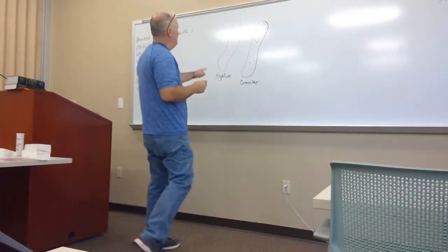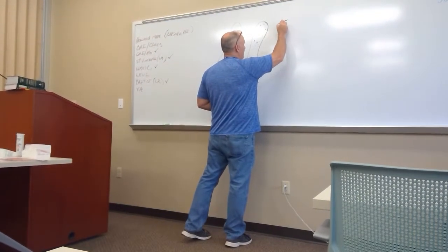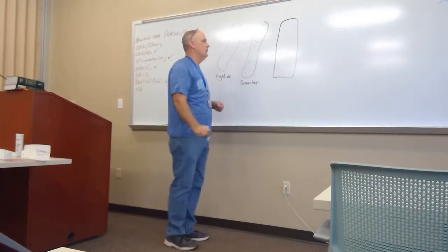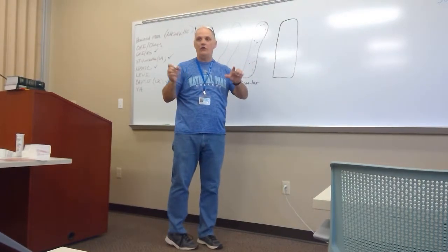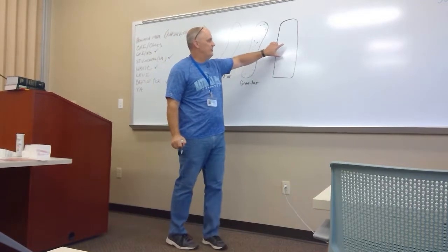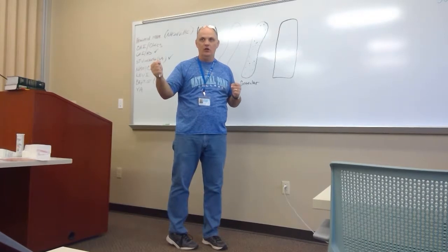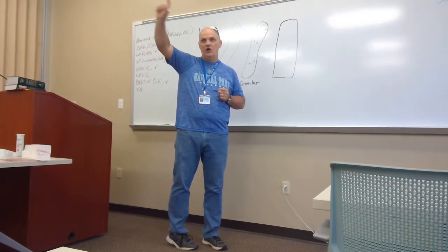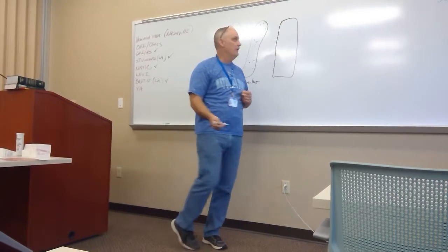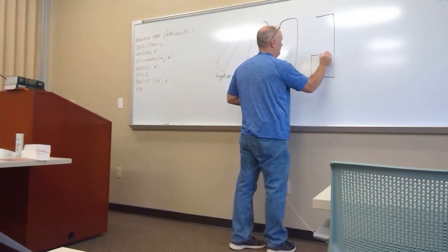So you've got hyaline casts, you've got granular casts. Another type of cast is called a broad cast. These are the ones you don't want to see. Your book is also going to talk about another one called waxy cast. You don't want to see these because they represent extreme stagnant urine. In other words, that thing was at that distal convoluted tubule quite a while before it broke off and went into the urine. And I think the waxy cast, sometimes they'll show them where they look like this.